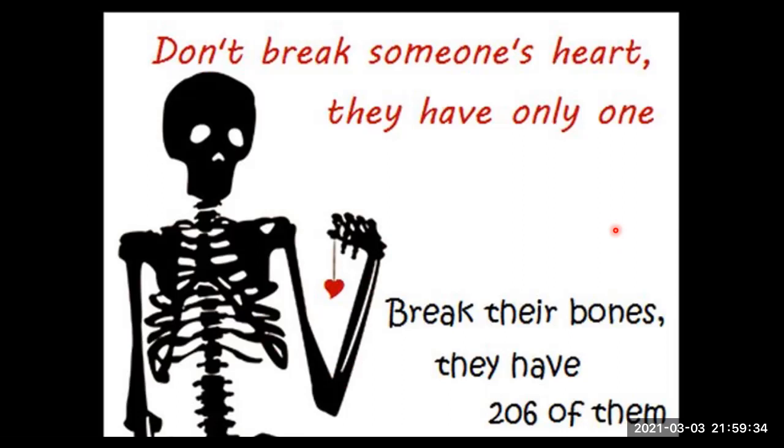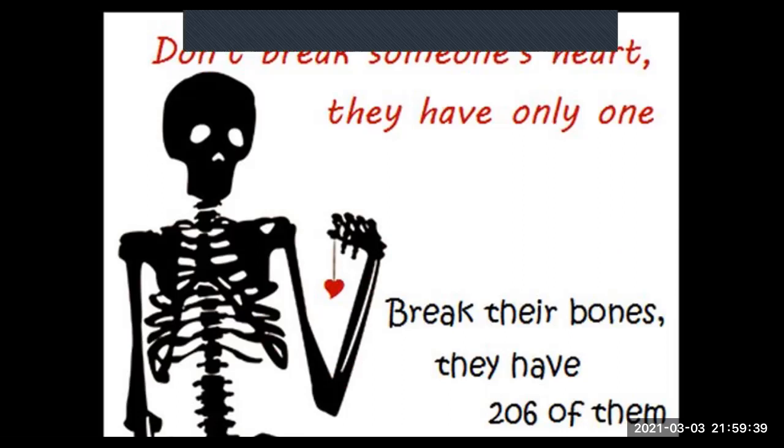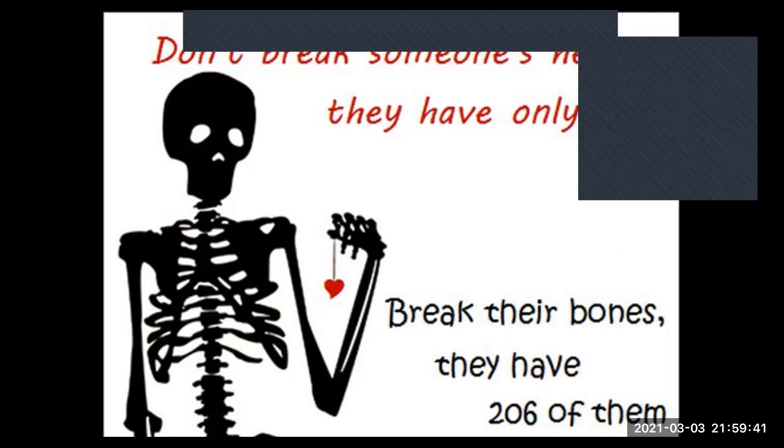So the next one that we're going to cover is actually the zones of the heart. So I'm hoping that we'll cover that, and then you'll understand what each part of the heart is being looked at by the different leads.